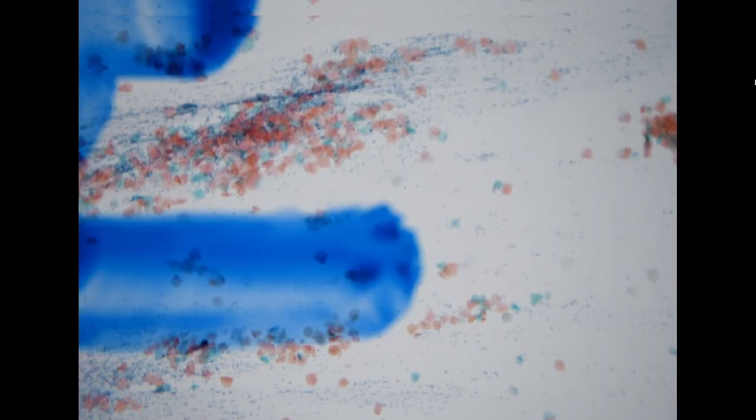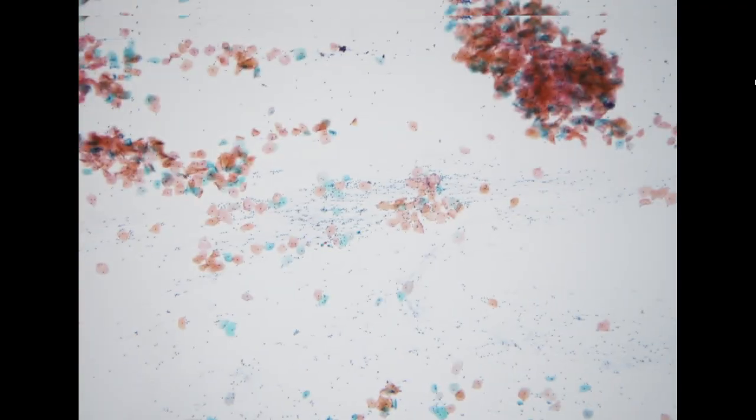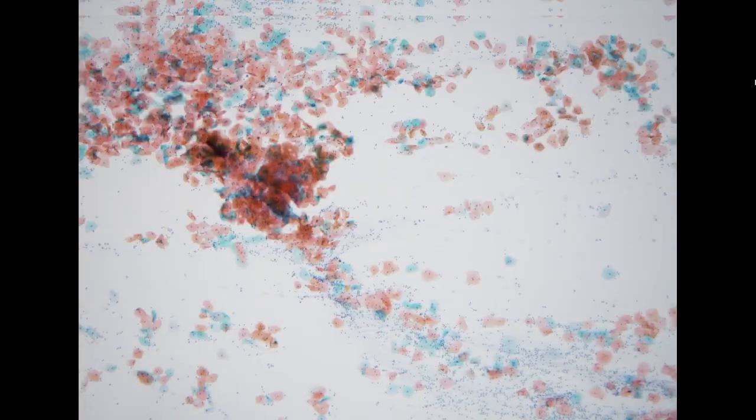So next, a 49-year-old female. She had a past history of an abnormal smear and a positive HPV, other type. This is a repeat smear for screening. She is 49, so relatively young, and you can see a lot of superficial cells. The background is very clean.